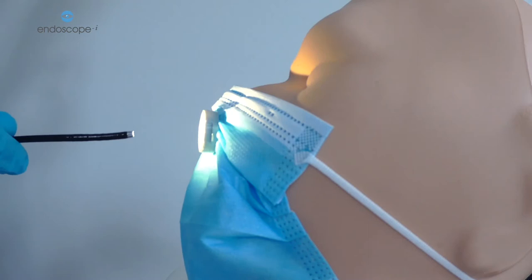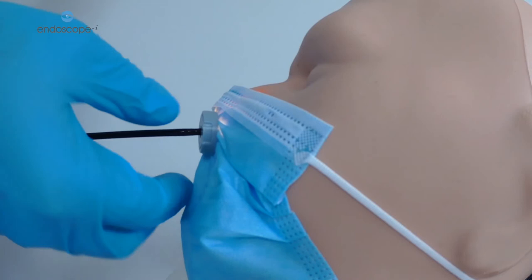When threading the scope, make sure that you're looking directly at the mask and at the patient, not at the screen. Make sure that the scope passes through straight and ensure there's no buckling of the scope. You'll feel a give as it passes through into the ala of the nose.